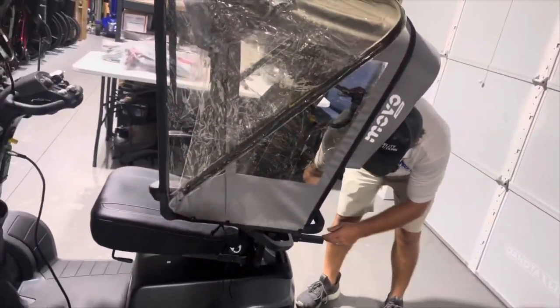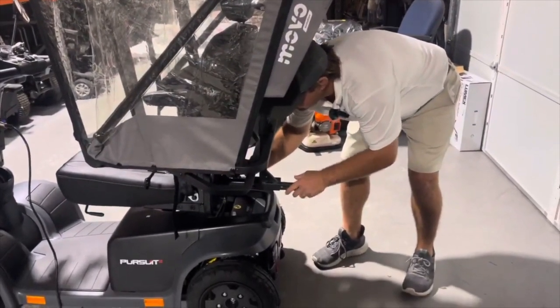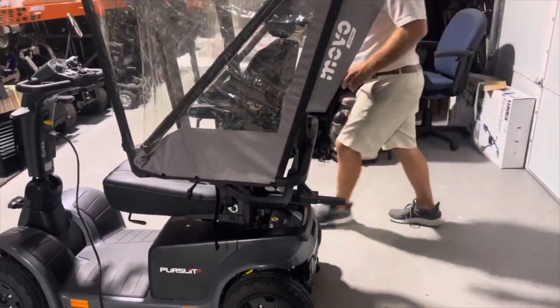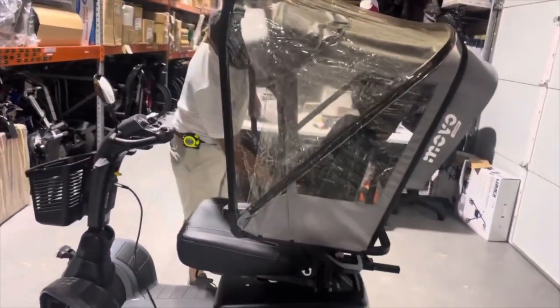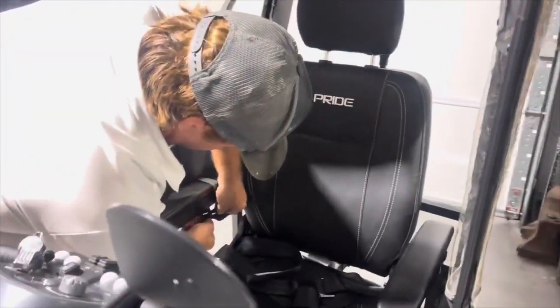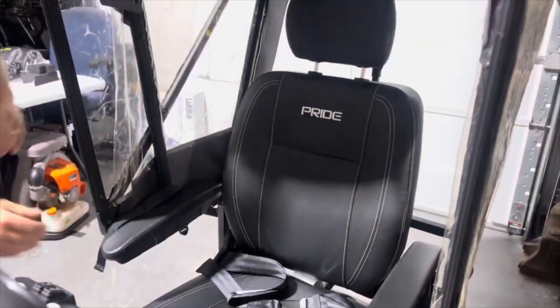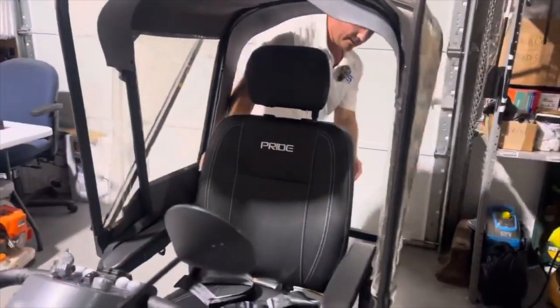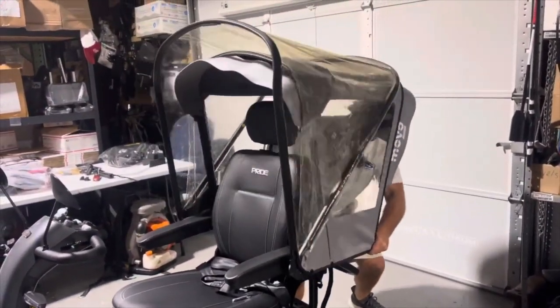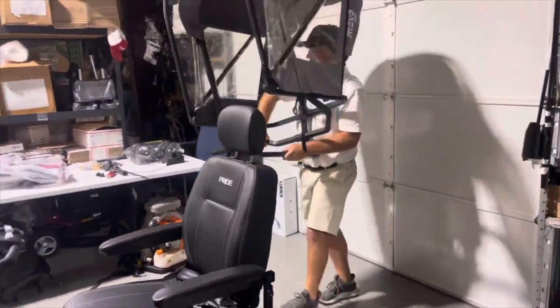And if you need to remove it, because you don't need it, just loosen it here. Unstrap your two straps inside. This goes on the arms. It's back. Two hands. Pull it right off.